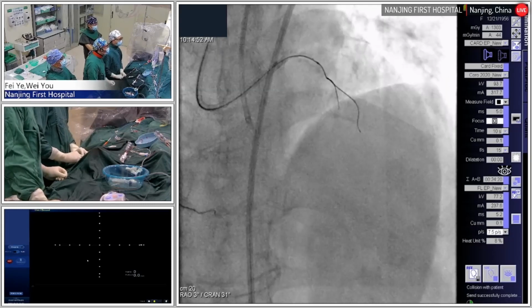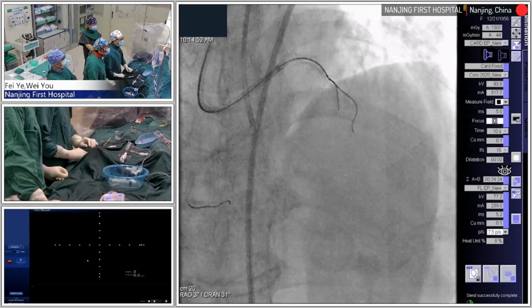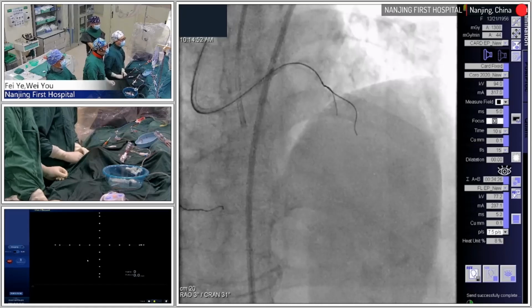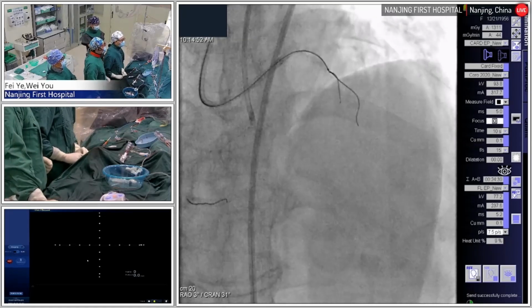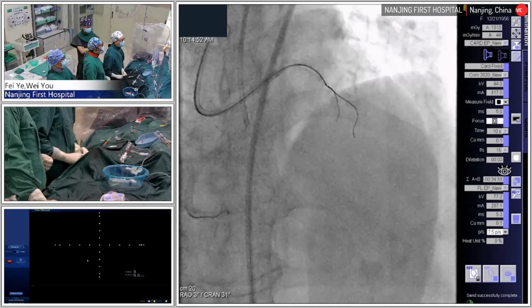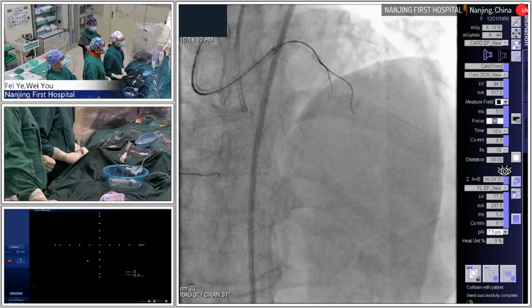You do not feel resistance on the wire. You can still see the bands. I cannot follow the microcatheter. Resistance may be better compared with no resistance, just because with the Gaia 2 or Gaia 3 in the subintimal space, we also cannot feel any resistance.